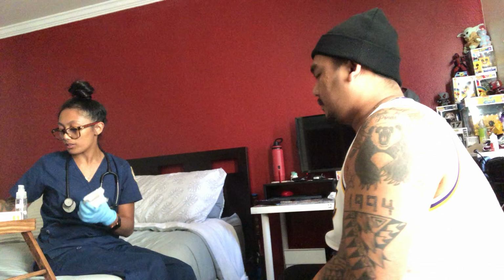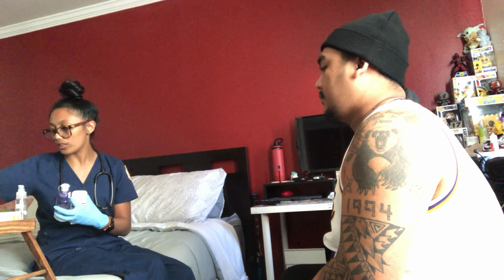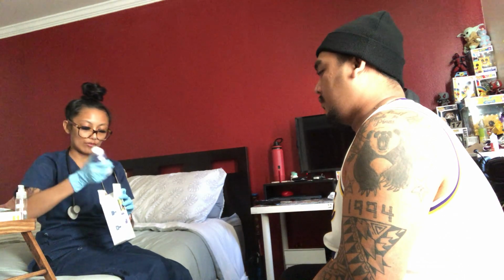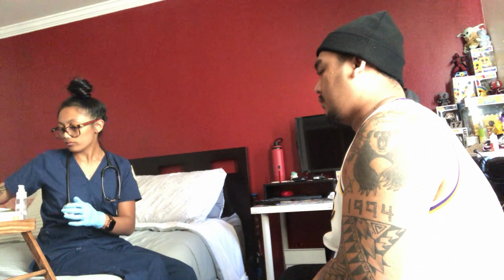When you take this, you will take it prior to taking your Advair inhaler. This is going to be a dry powder one. I'm going to go over it with you in a second. You always want to make sure you take this one at least 5 minutes before the other one so that it gives your airways a chance to open. Also rinse your mouth after each time you take your inhalers.